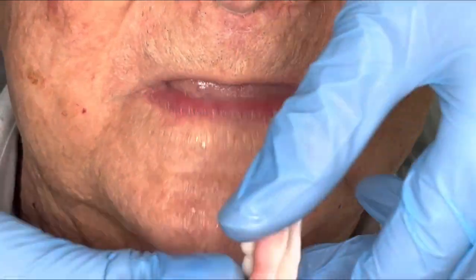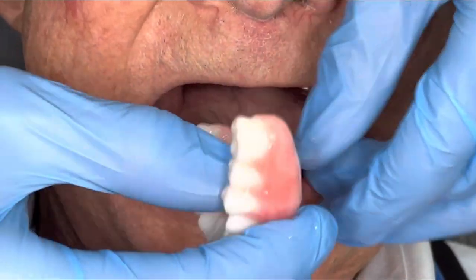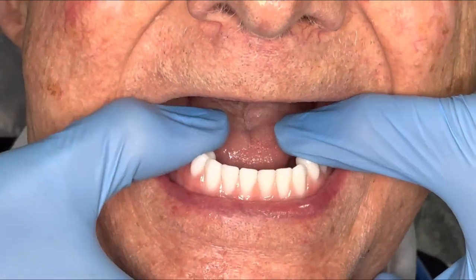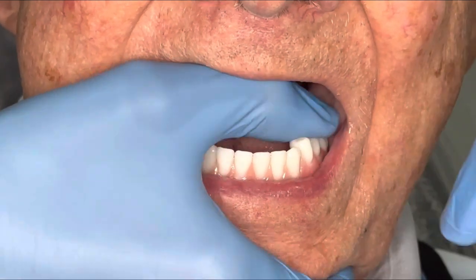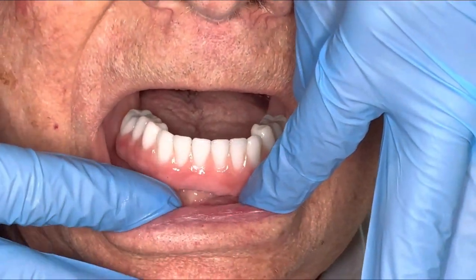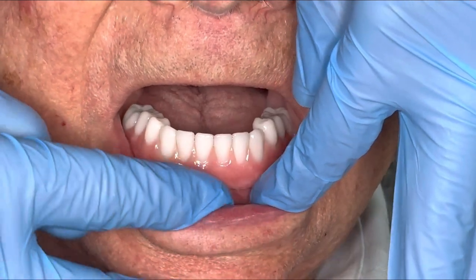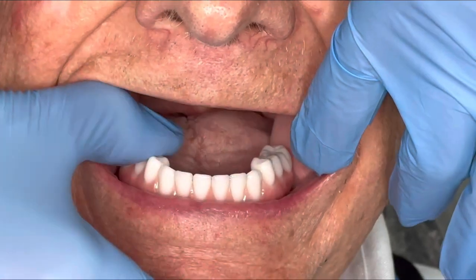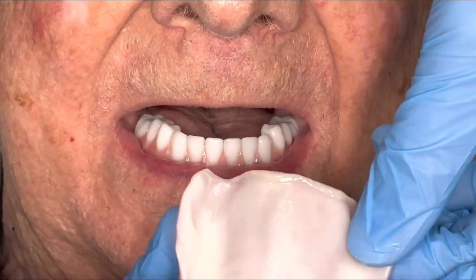So again, here are the clips there. We just settle it in place, push that down. And we design these much like a fixed set of teeth. You can see there's no flange like a denture. And gives you a nice solid base to chew with.